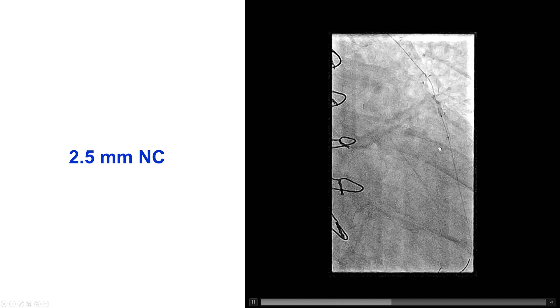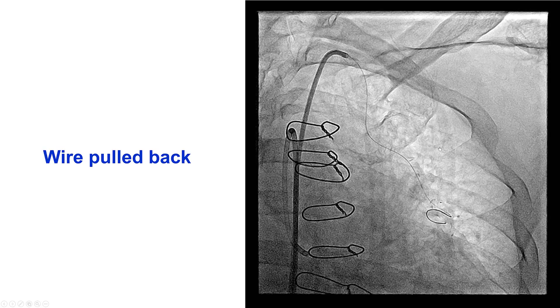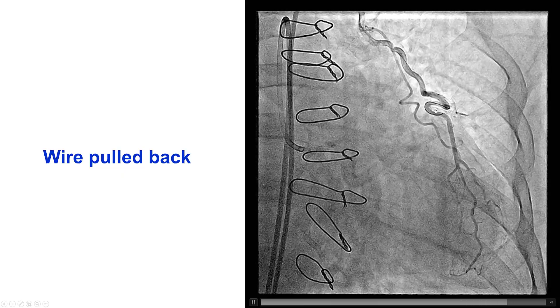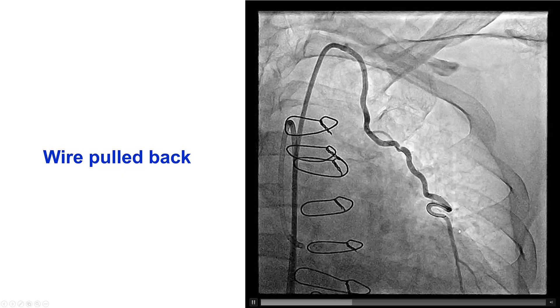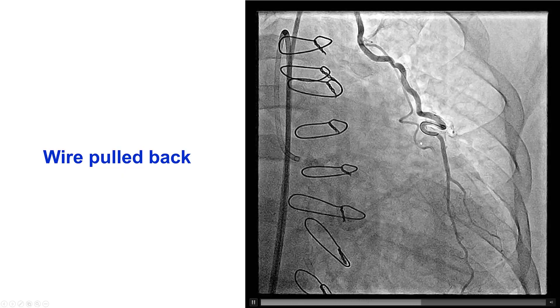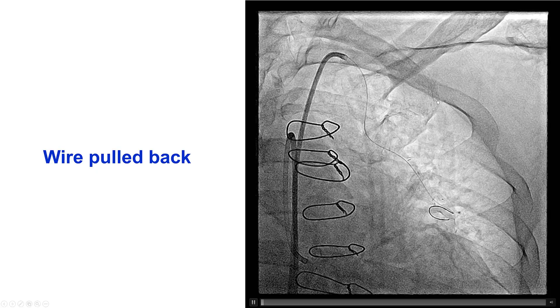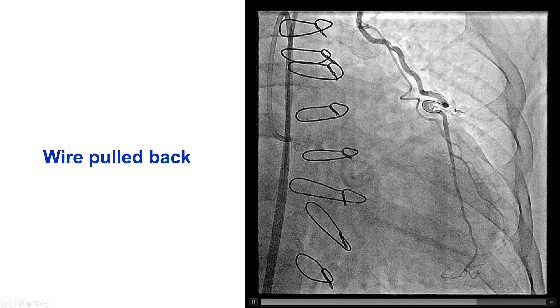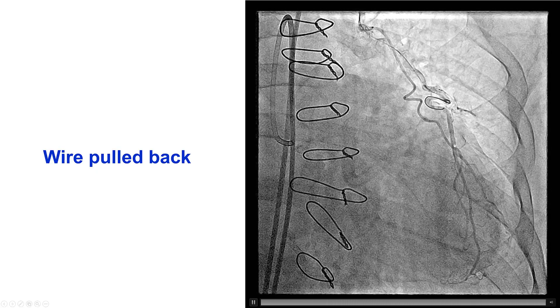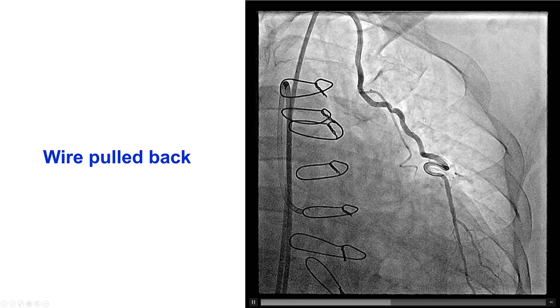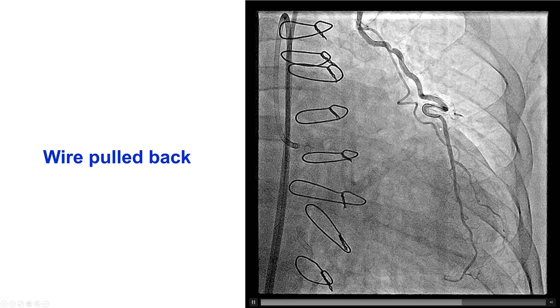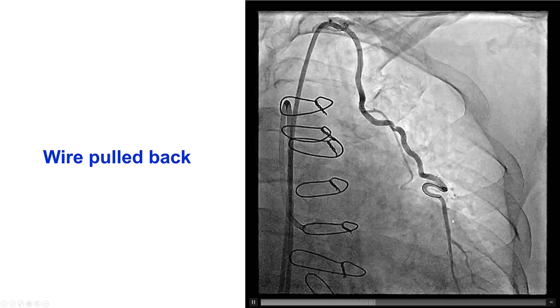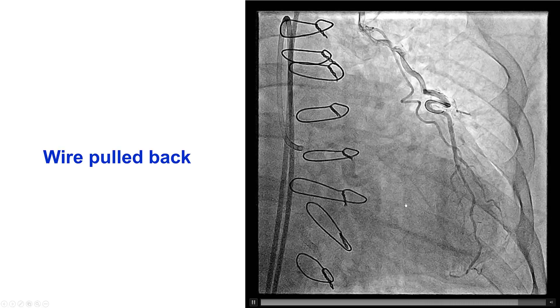We did post-dilate inside the stent, and we decided to pull the wire back. Our intent actually was to pull the wire a little back and leave the radiopaque portion of the wire through the stent, since it's the soft part of the wire. However, the wire did jump back. But fortunately, once we injected, we actually have good TIMI flow in the vessel and there is no dissection or other problem.